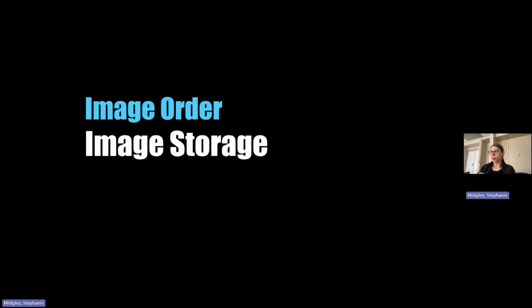The next part is your image storage. There are a couple of different options for image storage. Do you know what they are? If there's a physical copy, yep. So you can physically print a picture and save the picture. You can store it on the machine and export it onto a hardware external drive and house that. You can send it to PACS or you can send it to some third party.